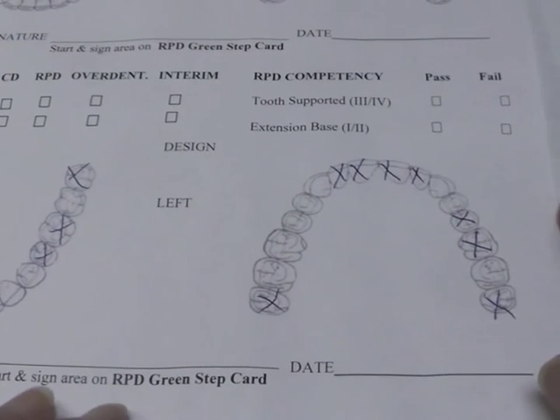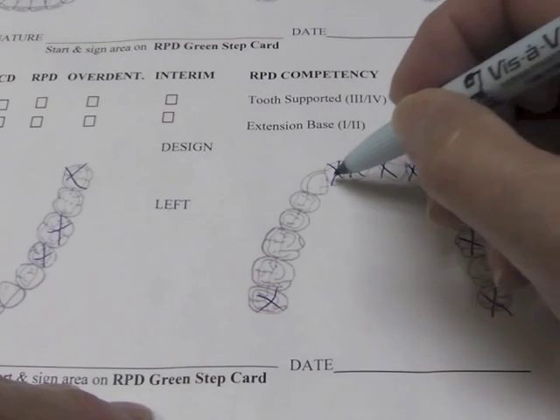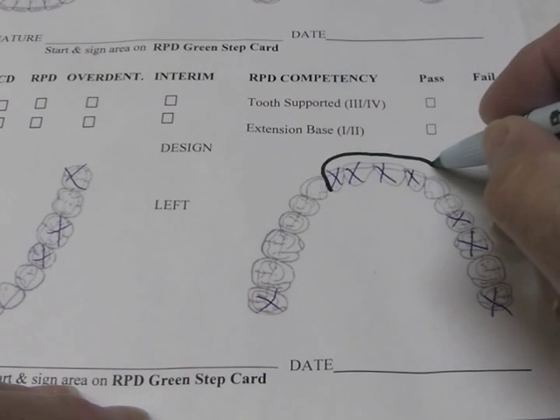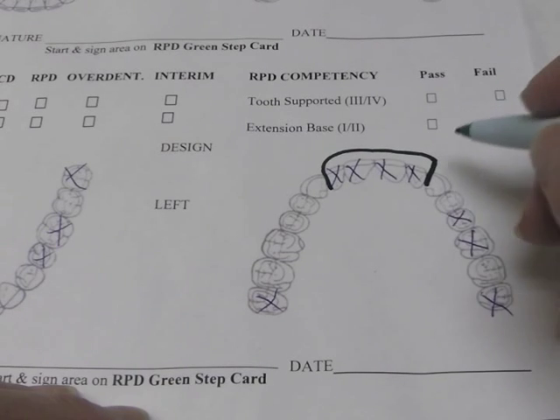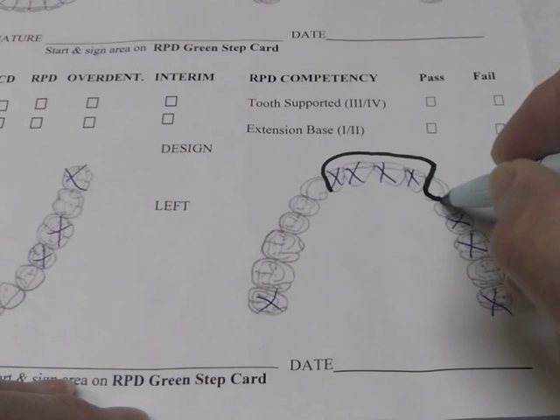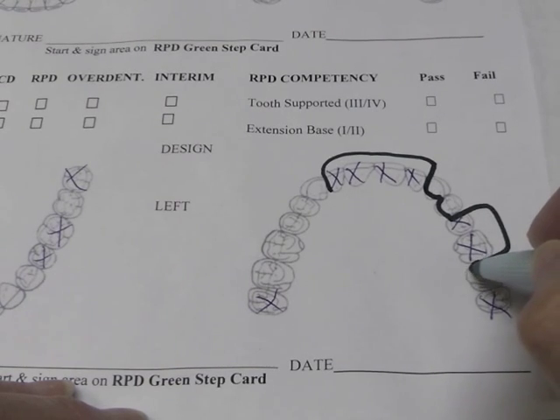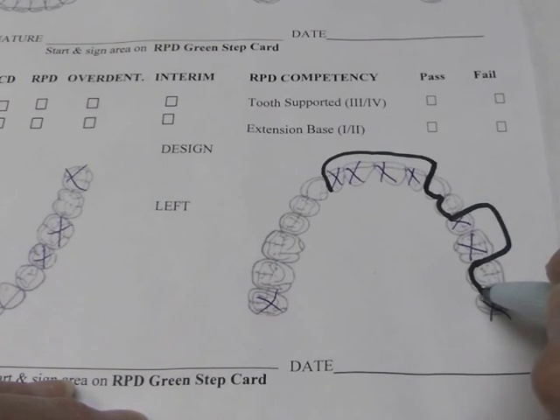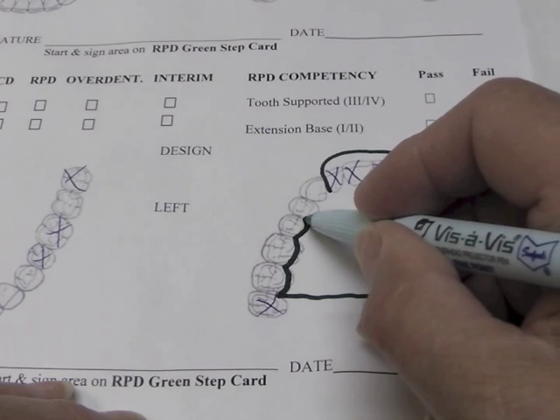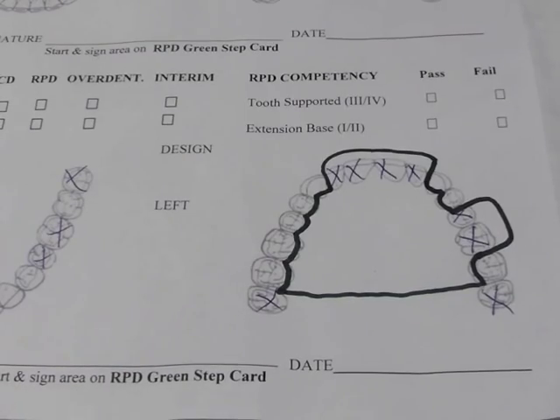I've crossed off the teeth that are missing on the cast. The general design I would follow is: I'm going to come down through here and have a flange down to within three millimeters of the base of the vestibule. I'll plate this tooth and that tooth, then bring my flange down in this area and plate that one tooth back there for stability. Then I'll come across the arch, plate all of these, and join it to that point. So this will be the general design of my maxillary base plate.